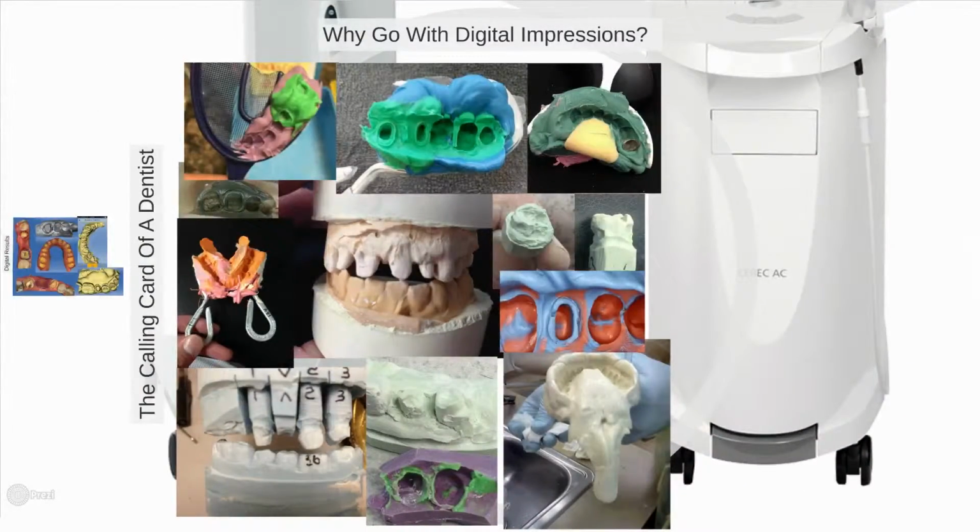When looking at traditional impressions, I don't think I need to go into much detail of why you would want to switch to digital impression. Here are just some great examples that a lot of you have probably seen in your practices of what can happen when using a traditional impression.